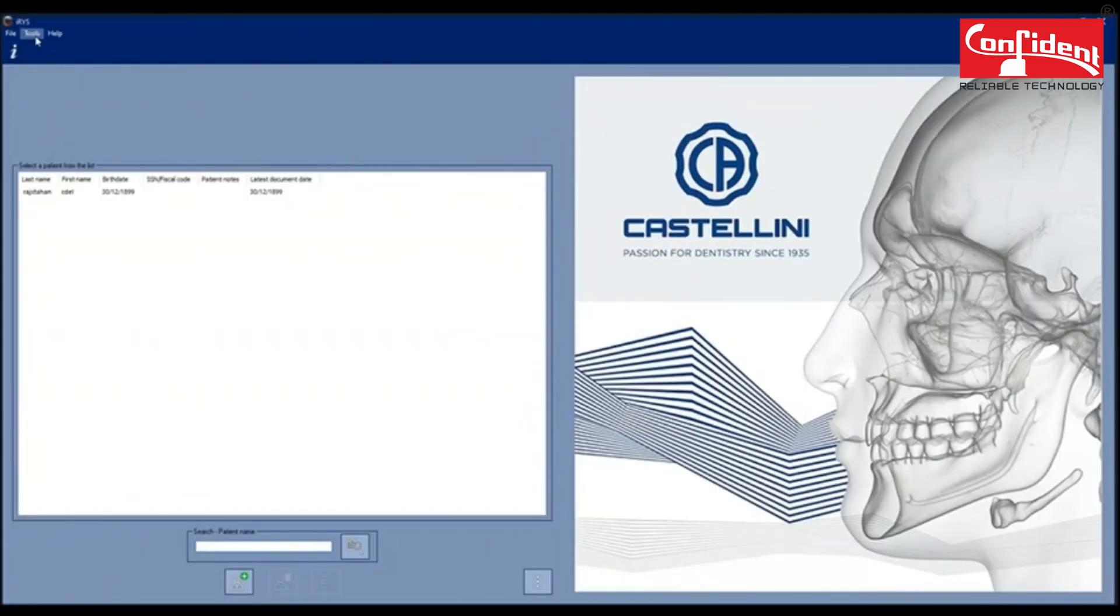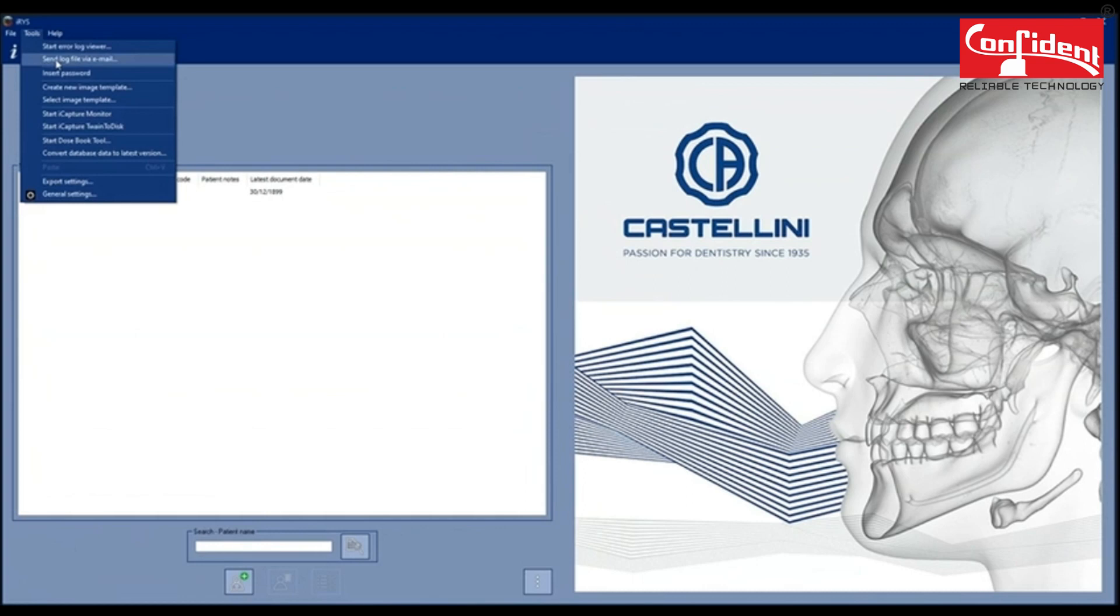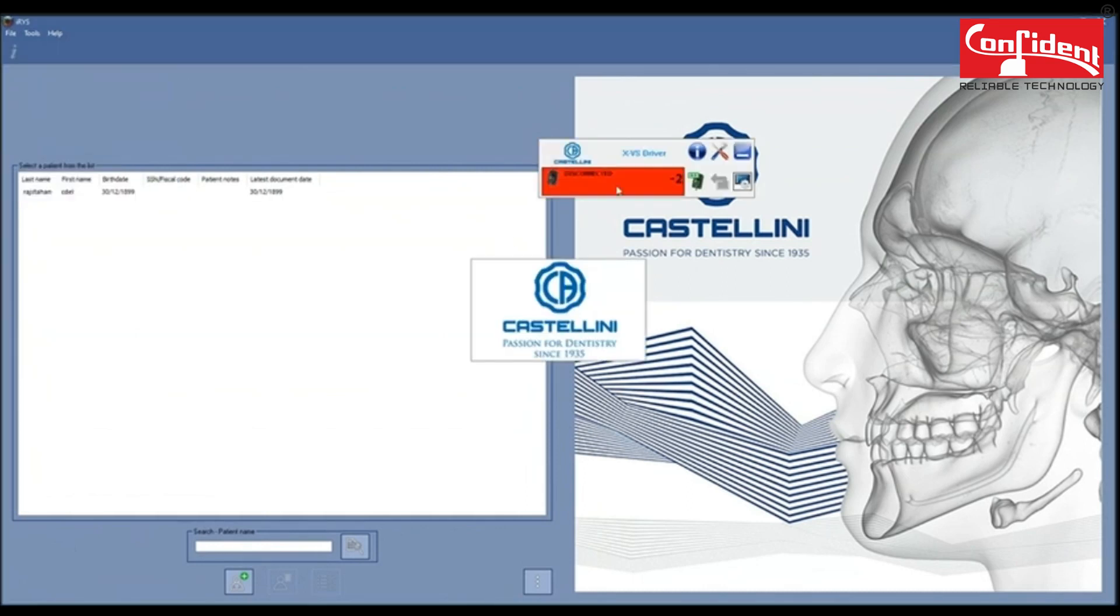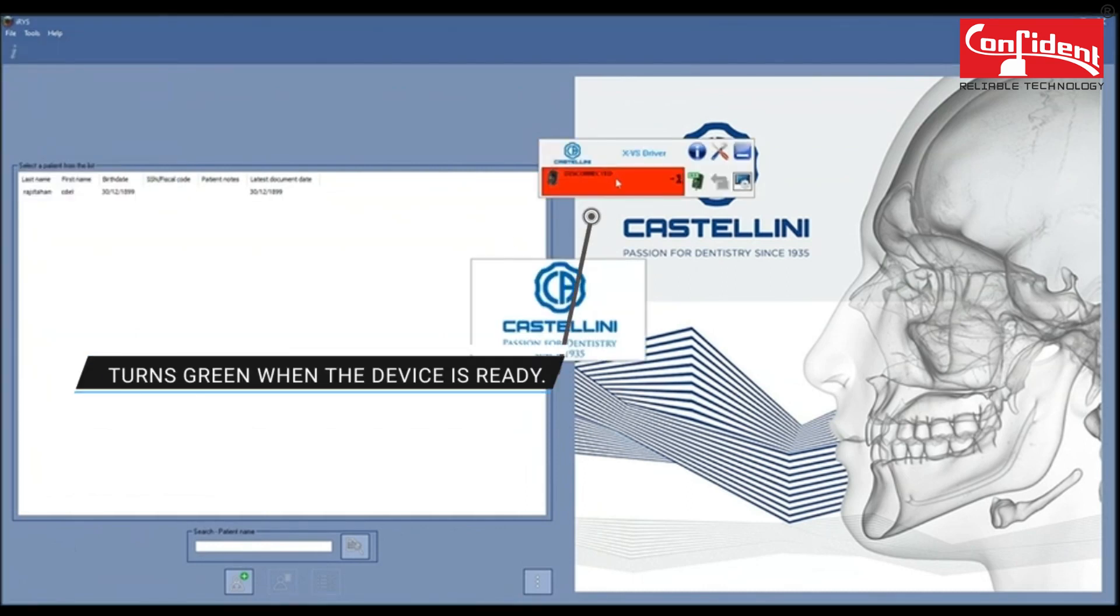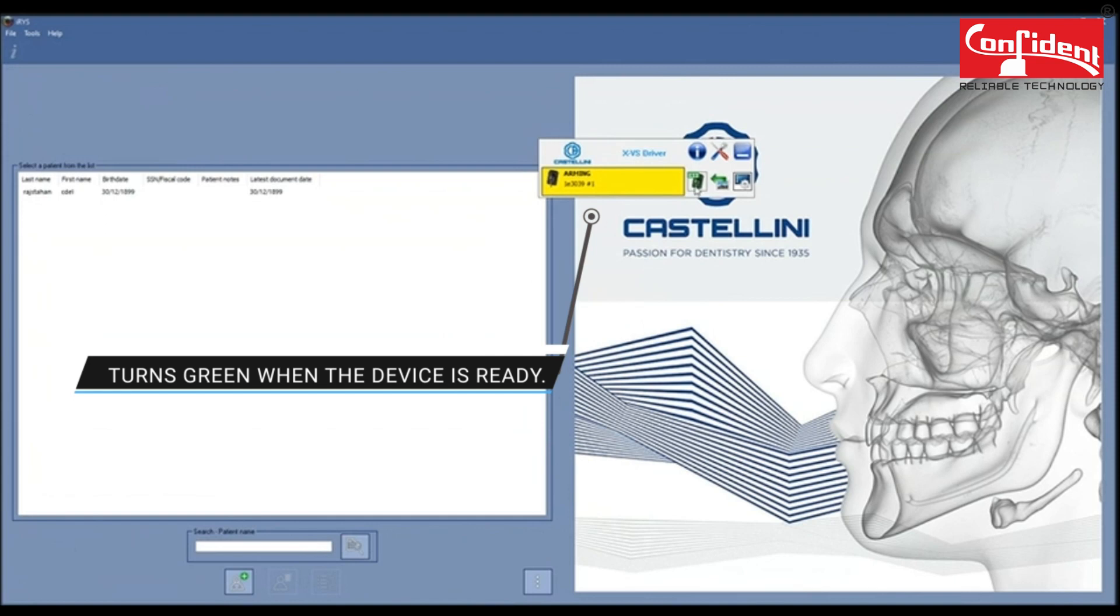Under the Tools tab, click on Start iCapture Twain to Disk. A pop window opens up and shows the status of the device. It turns green when the device is ready to scan.